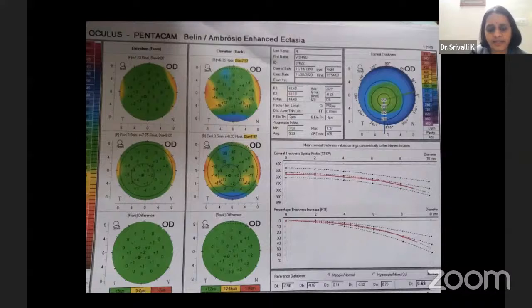And again, another easy thing for you to see is all these indicators, the QS value and the scores below, whatever is given. So see the color of the box. If it is normal, then it will be showing you in white background. If it is borderline, it shows in a yellow background. And if it is in red, then definitely it's abnormal. So that's the color coding already given below all the three circles which are there.